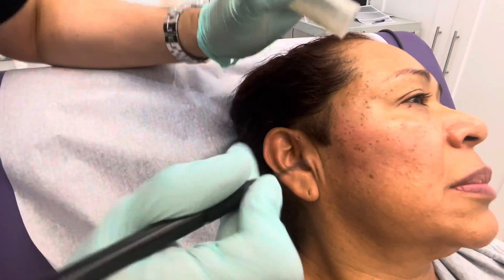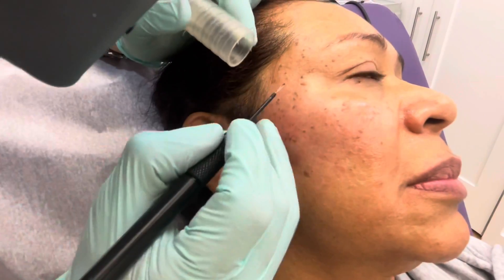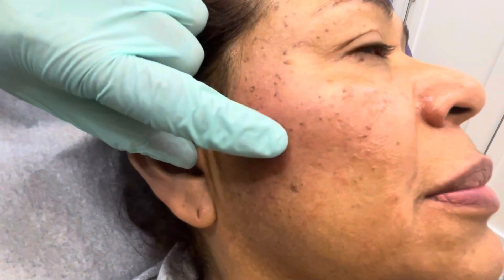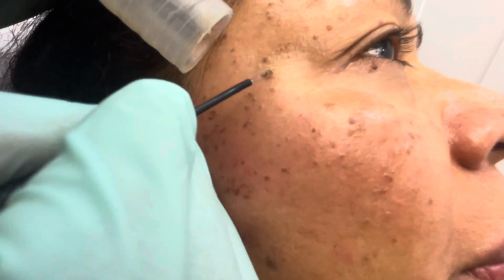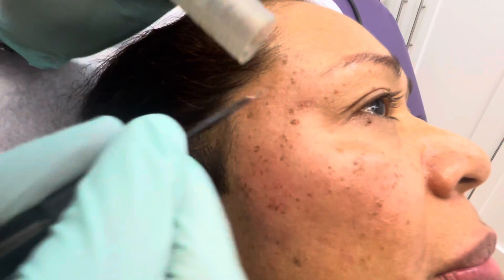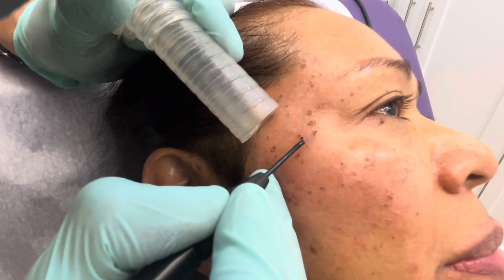You can see how we remove those. It's very important that patients don't move, so they don't cause any unnecessary trauma. Those radio waves, it's like a scalpel — it destroys on contact.